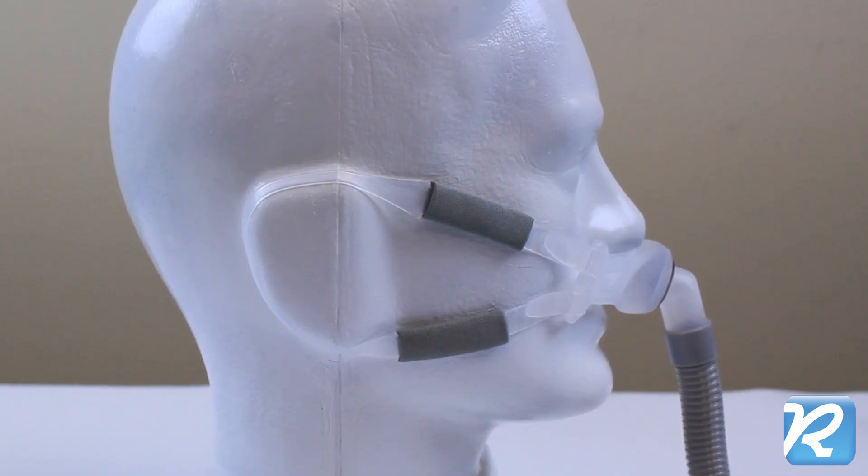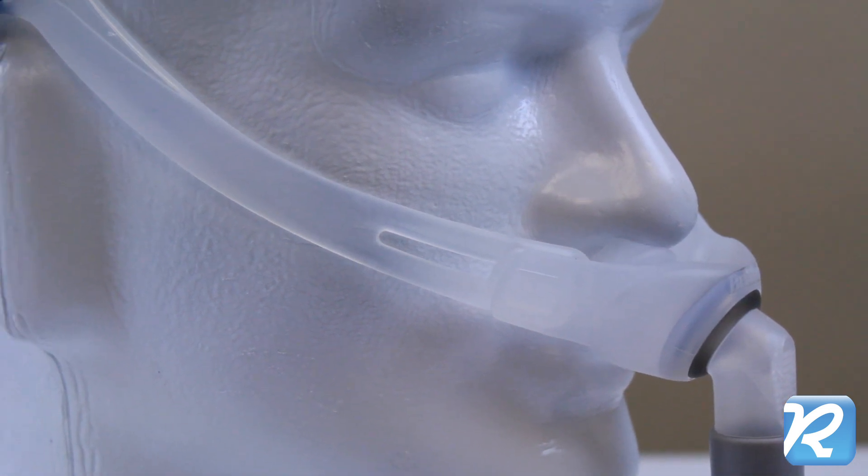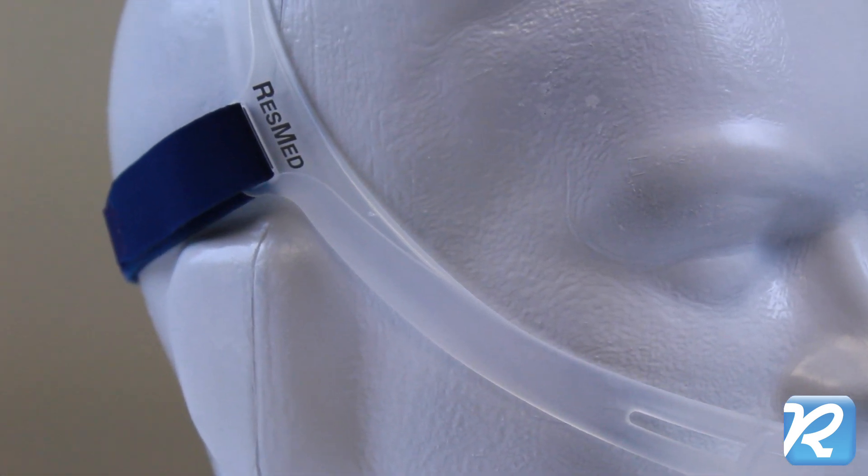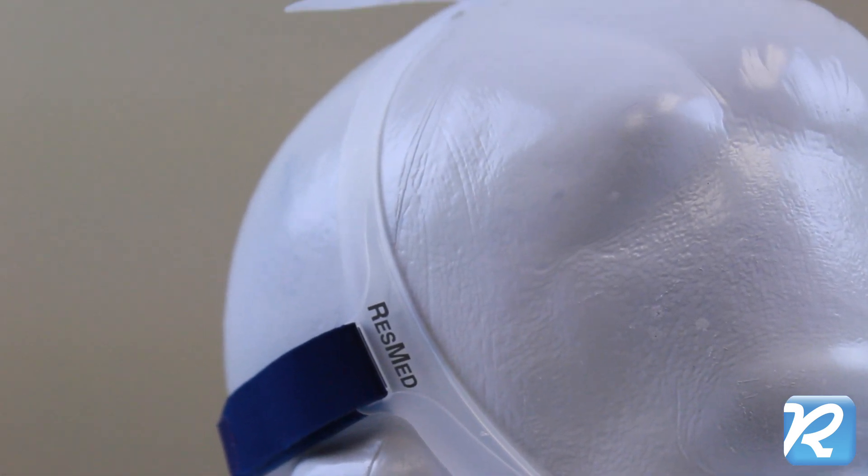The loops adjust over and under the ears with Velcro adjustments. The SwiftFX Bella Gray also includes the standard SwiftFX silicone frame and head strap.